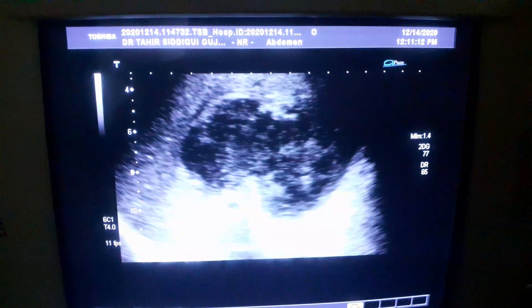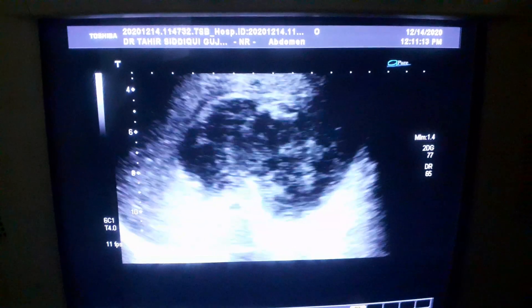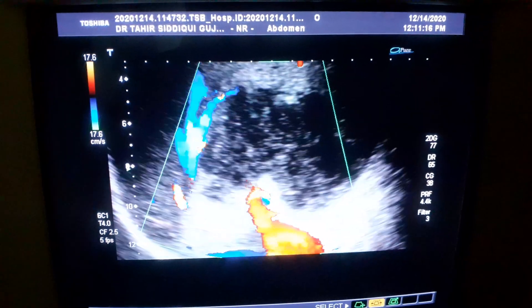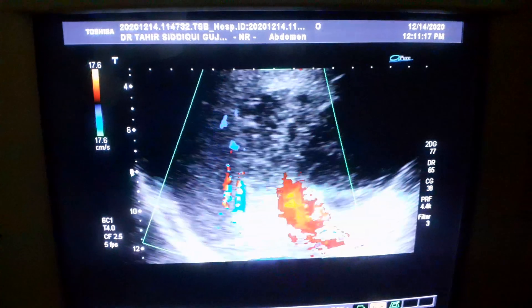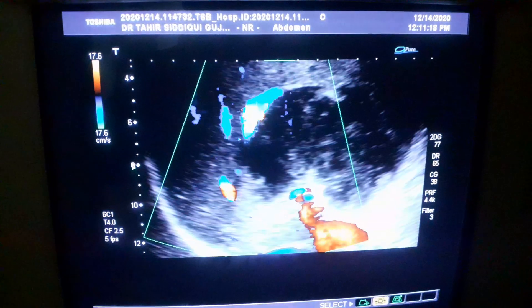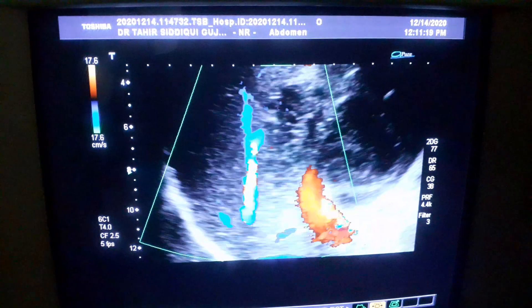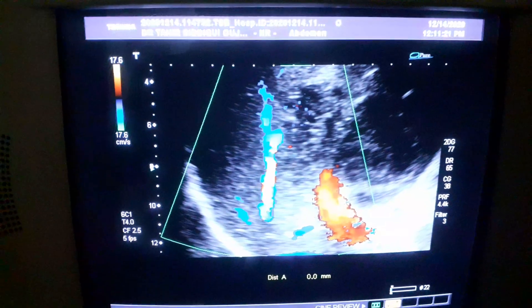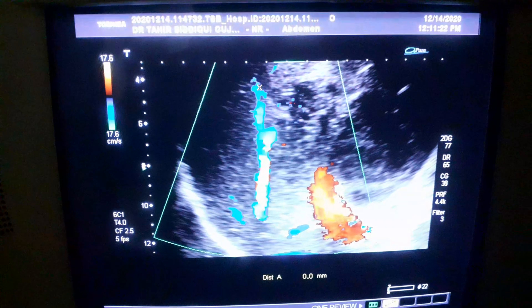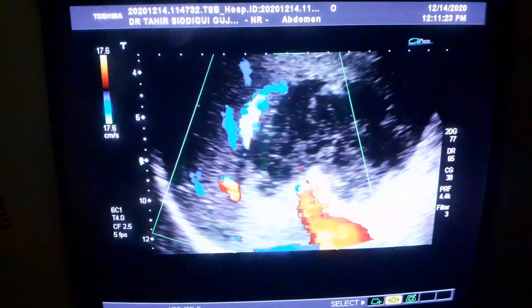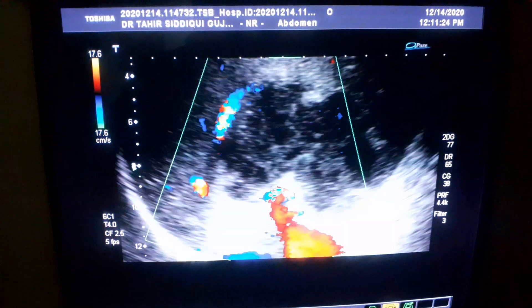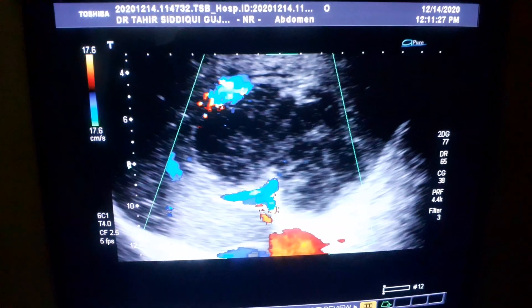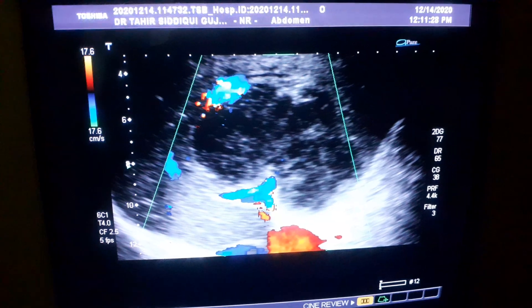And above the portal vein is the middle hepatic vein — this is the middle hepatic vein. This is our case of the day. Thank you very much.